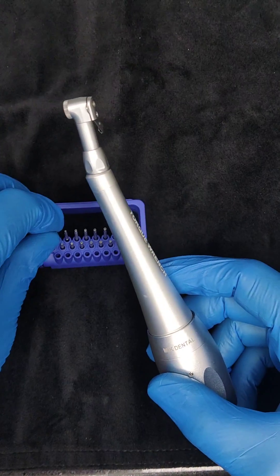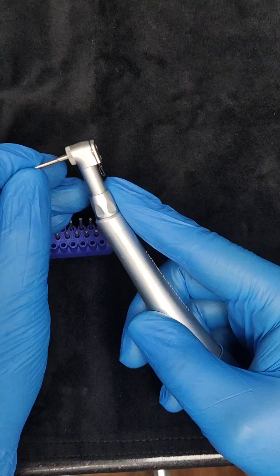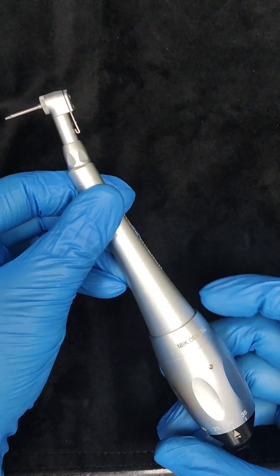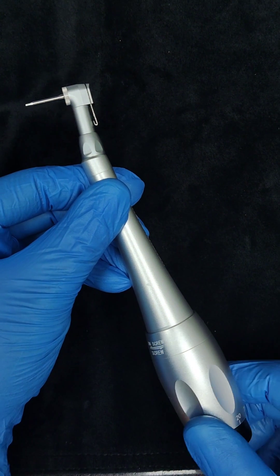If you want more details about this device, all you need to do is write 'torque' — T-O-R-Q-U-E — in the comment section, and we will let you know the cost of the device and where to procure it from.